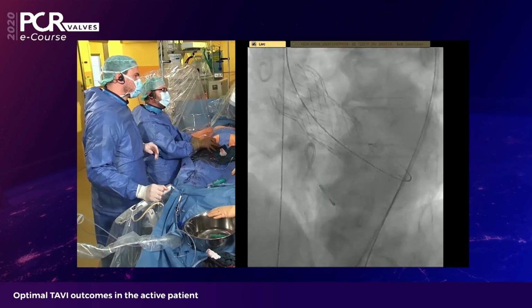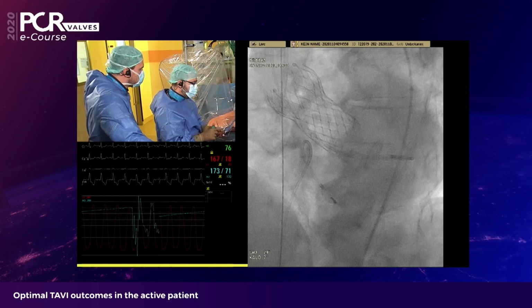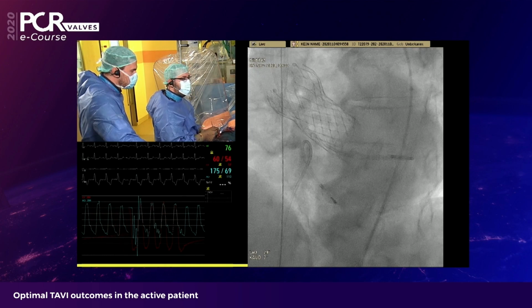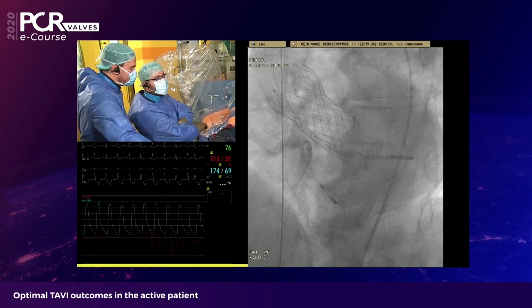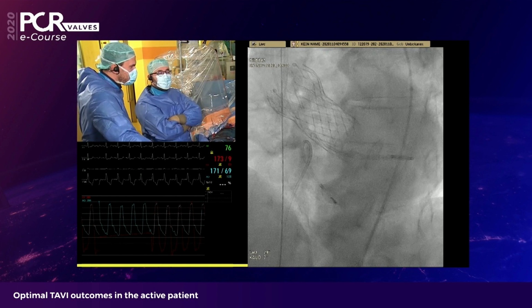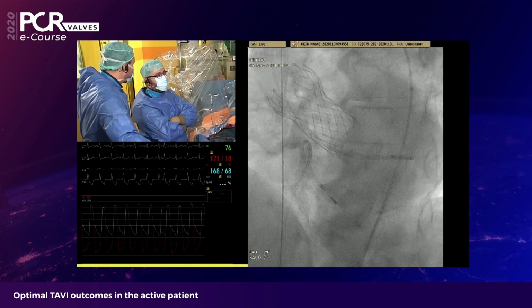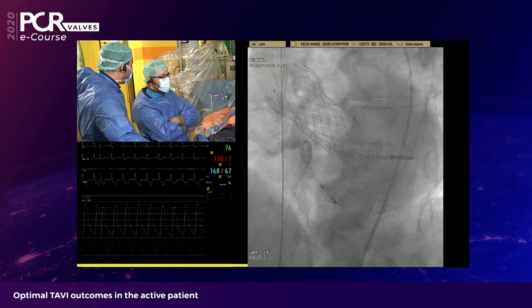Okay. As a surgeon, you do the alignment naturally. Yeah, you don't know anything else. But why didn't we think of this in the early days of TAVI? We were just happy that we were implanting the valves. We weren't thinking about all this fancy stuff, like the septum and commissural alignment and so on. Well, that's a very good point. When I remember the times when we started TAVI, there were so many other complications that we were facing, and we were really happy to get the patient out of the OR in good shape.